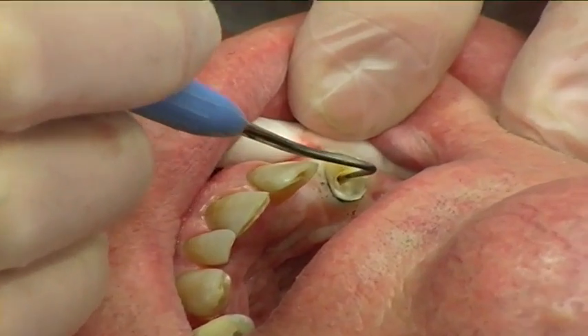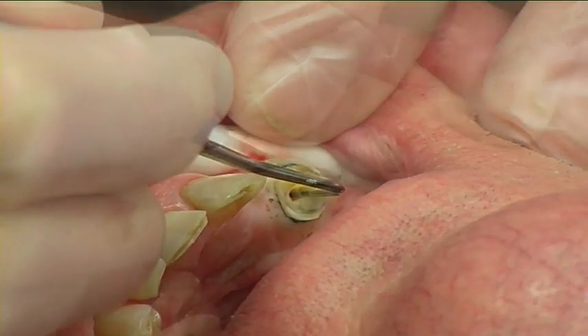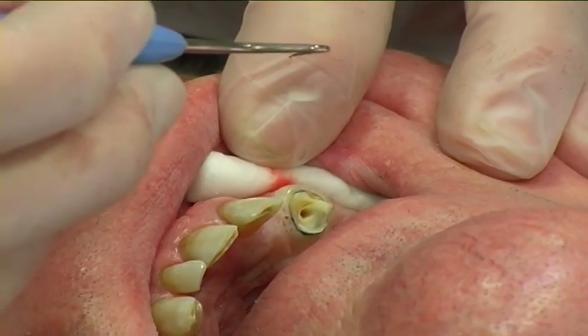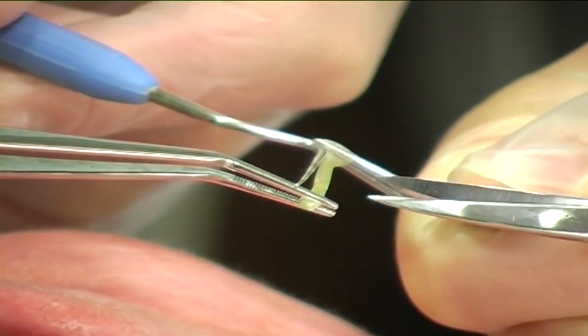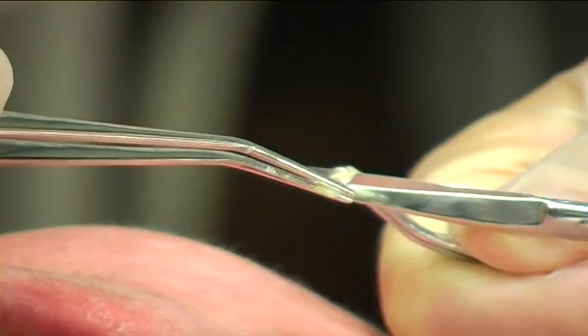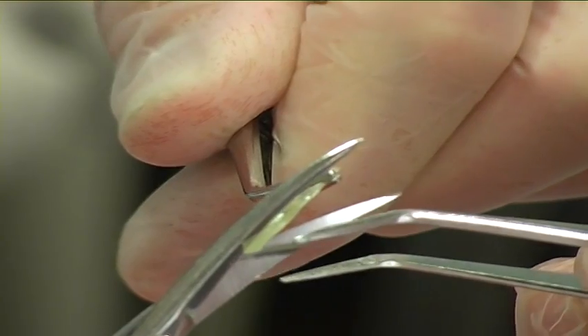The depth of the prepared canal was measured using a periodontal probe. Also, the height of the coronal structure needed was estimated. The post was cut to a suitable length with sharp scissors, and the end of the post was tapered with sharp scissors.